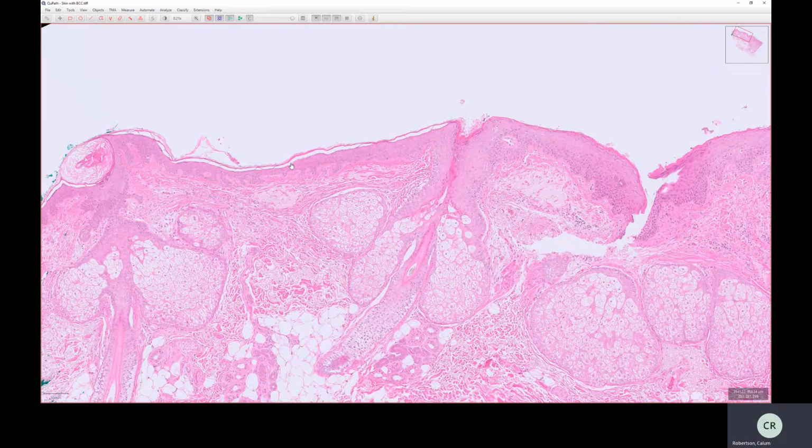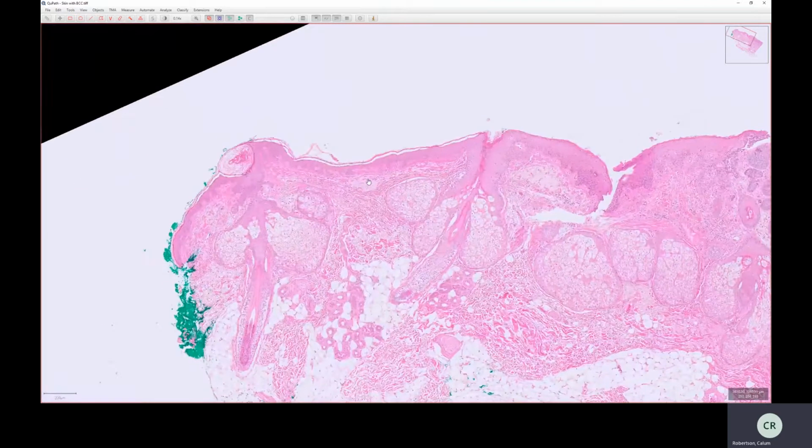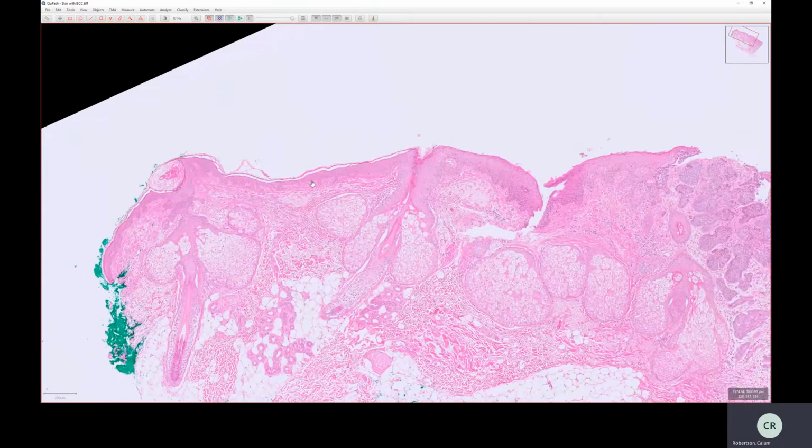You can also get thin skin, particularly, for example, in the abdomen. It doesn't have to deal with a lot of pressure. It's a lot thinner. And this skin is probably from the face. Not exactly sure where it came from. Here the skin's sort of somewhere in between.